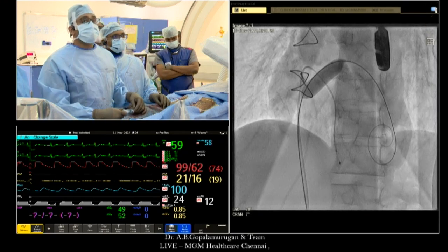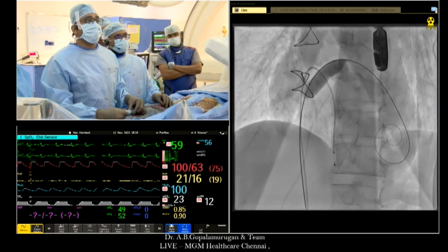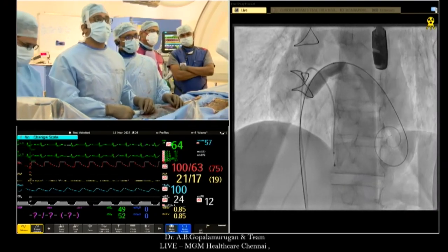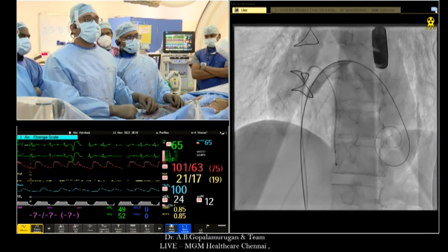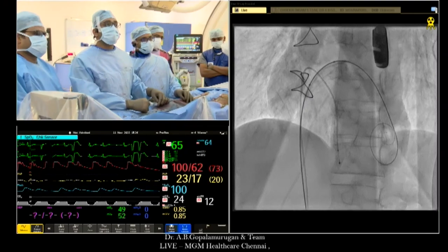Ideally, you should have a Sentinel, but Sentinel being extremely expensive, we don't do this. We've just got away even with the very mad procedures, BASILICA and LAMPOON. We've not had any clinical strokes, but I'm sure we showered enough into the brain. But coming to the point of taking the balloon through the valve, I wouldn't recommend that. I'm not saying you have to take the inflated balloon.